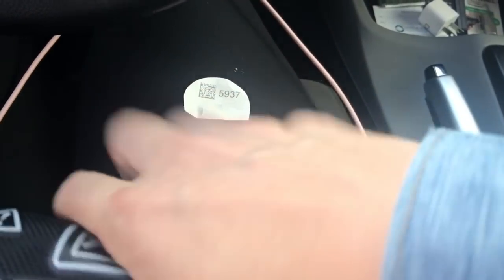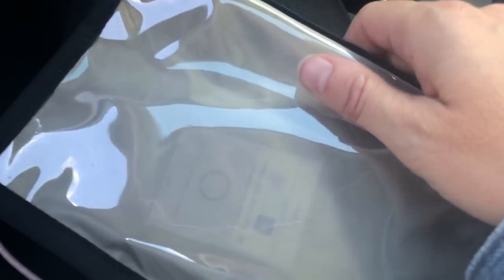It goes in there and it stays in there. Signal loss for two hours. So come back in two hours, and we'll bring it out of the bag and we'll get ready to reconnect.